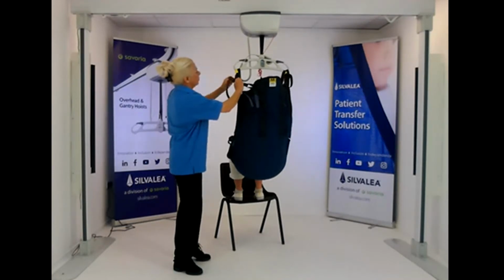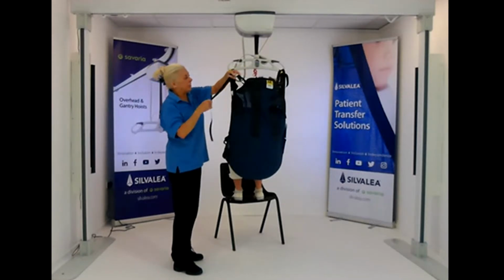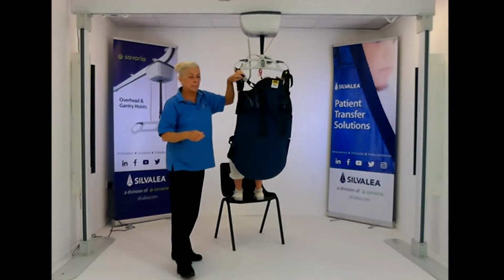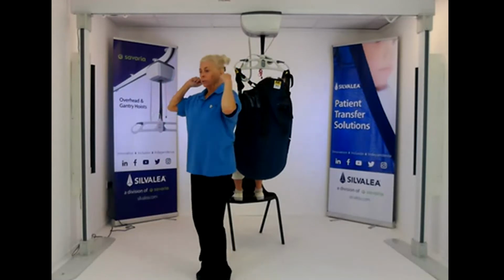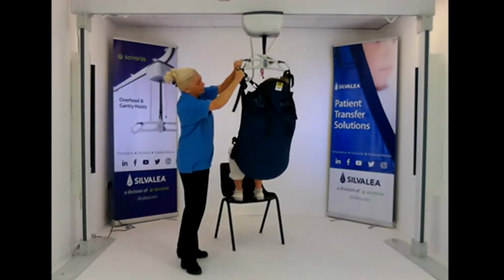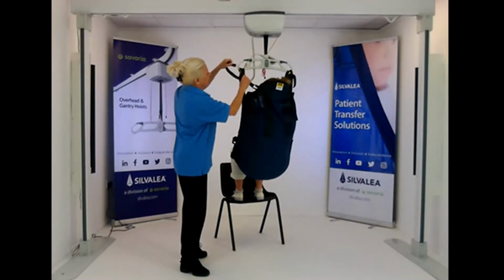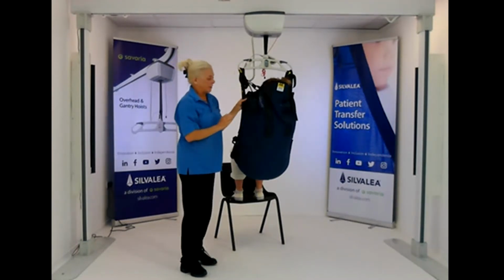And they are on a slider buckle. Undo that so that you can see. But you could take it directly up to the spreader bar, because sometimes the direction of the tape helps. And if it's too low, it may not be as supportive. So you could take it up and it gives a different direction, if you can see up there. And then you take it back through the slider and through the other side. So it's got to be secured that way. So you've got an option there.